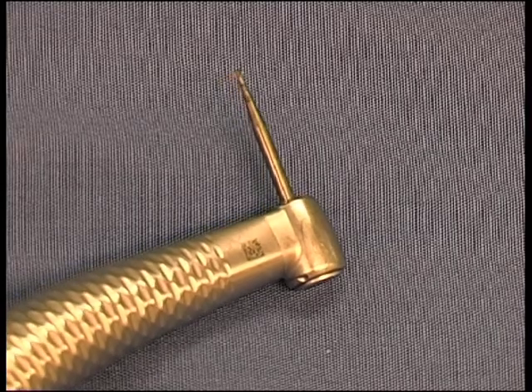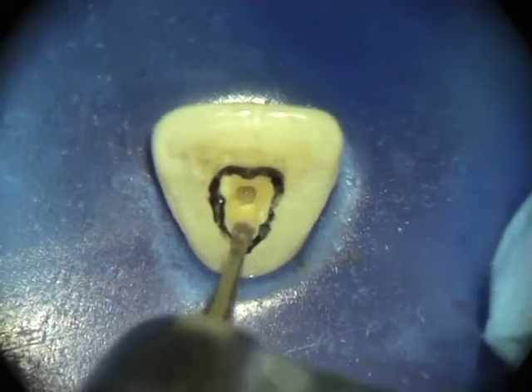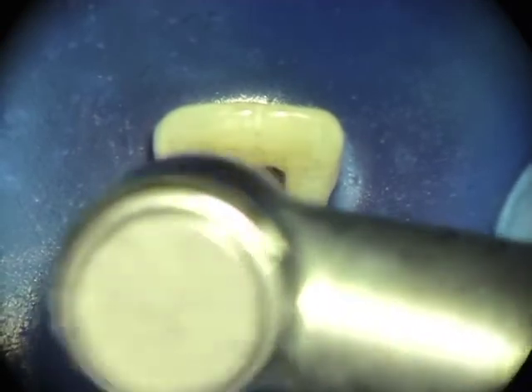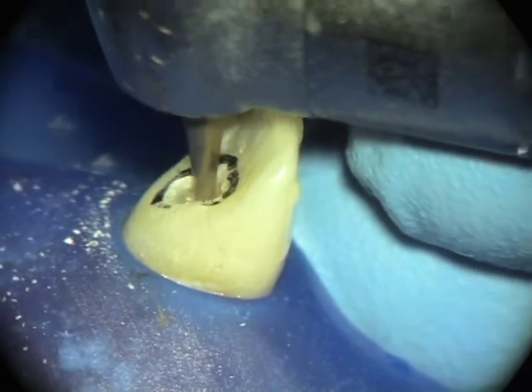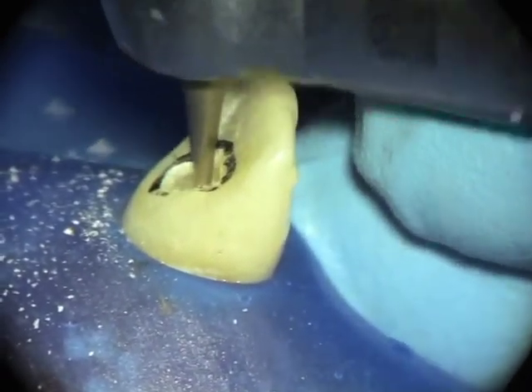The roof of the pulp chamber is now removed with a rosehead burr. The burr is used in an occlusal direction in an attempt to lift off the roof of the pulp chamber. It is important not to enter into the depth of the pulp chamber.